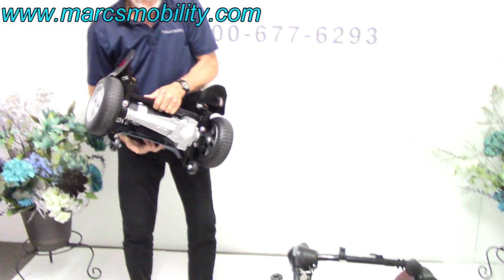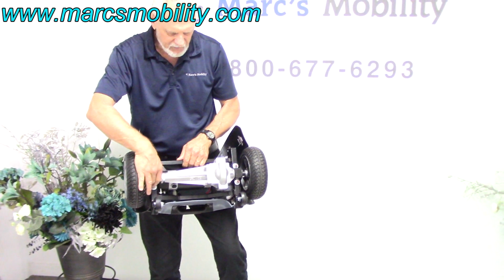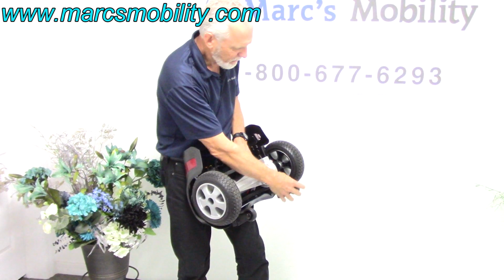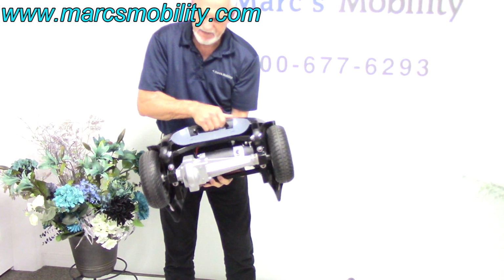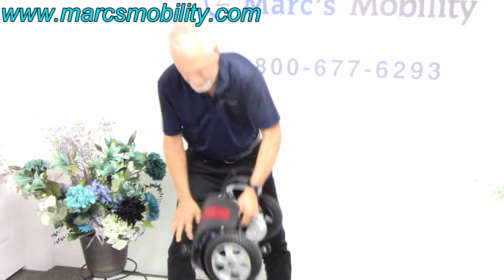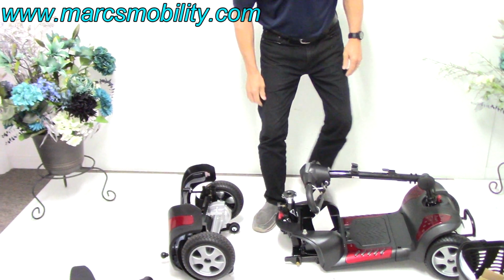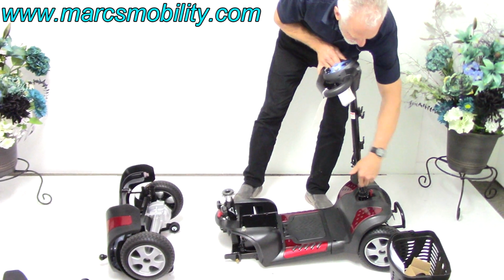This is your rear. You can see the motor right here. You can see it's a direct transmission, the motor goes directly to the wheel. There's no chain, no belts. You can see the anti-tip wheels here for the back of the scooter. That's your back end. So when you put it back together, you want it sitting up like this. This is a real good one because it doesn't move once it's up like that. Then you would put your tiller back up so it's not in your way.